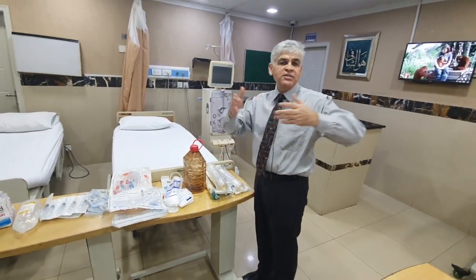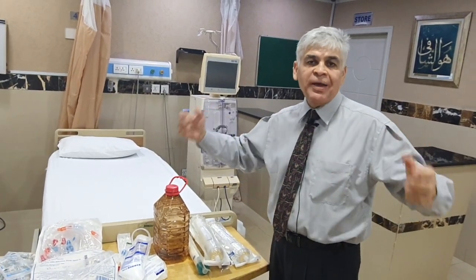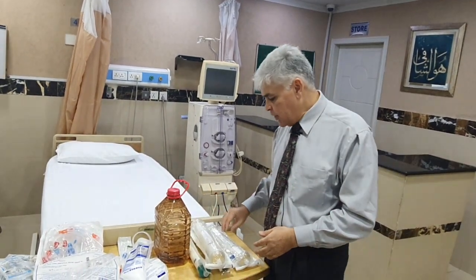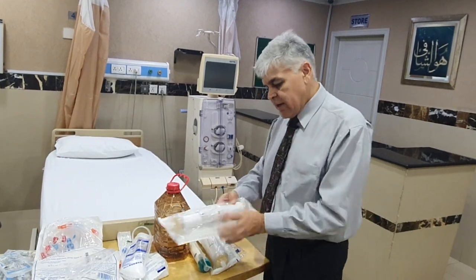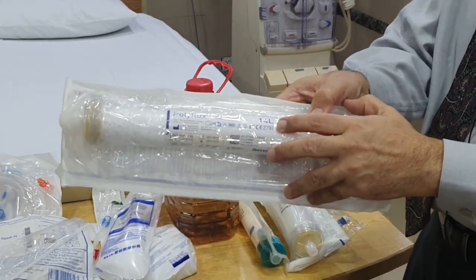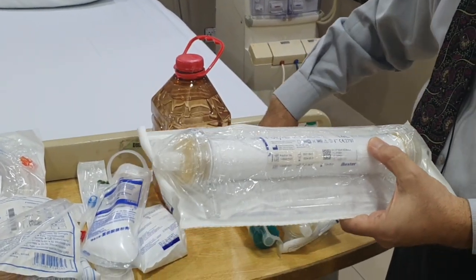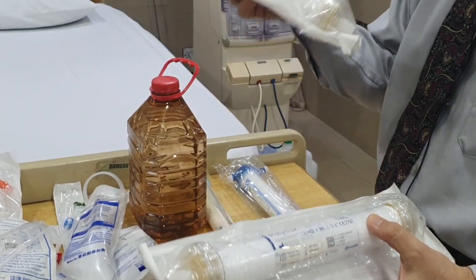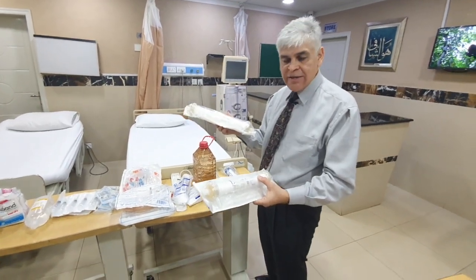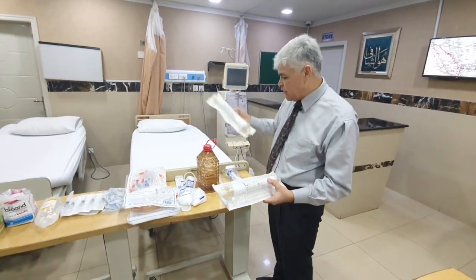For obvious reasons, if you've got a larger surface area, you tend to get more clearance. If you've got a smaller surface area, you'll get less clearance. So if you've got somebody who's big and bulky and needs more clearance, you can use a larger surface area dialyzer as compared to a smaller one. This one is a 1.4 dialyzer. Obviously, this is not intended for somebody who's big. If there's a 65-year-old woman of a thin frame, she's petite, you don't want to use a bigger dialyzer, because otherwise she'll feel extremely weak at the end of dialysis. When there is clearance, there is loss of lots of good things as well during dialysis. You can't stop that. It's just part and parcel of it, because it's simple diffusion. And so this one is meant for those who are big and bulky.